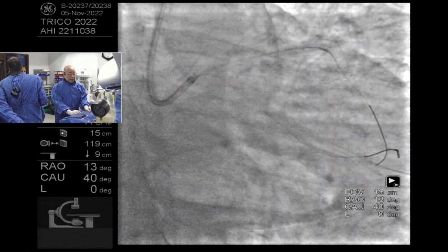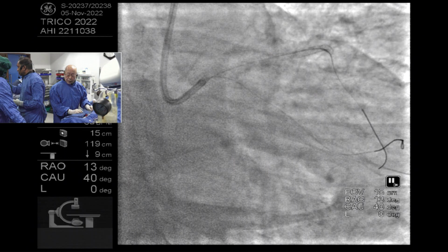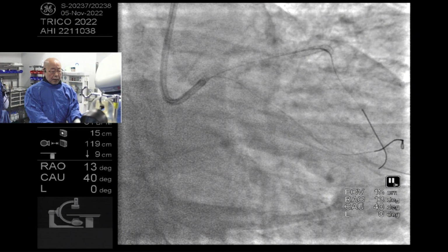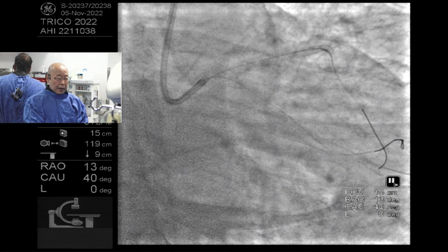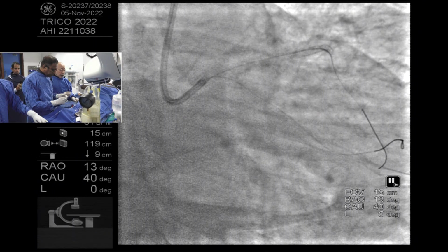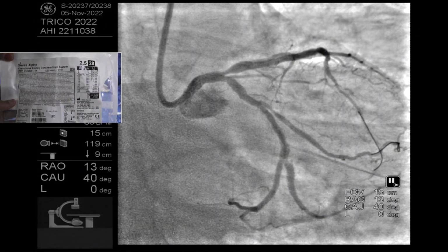Dr. Saito, any opinion about drug-eluting balloon over here? Do you have a drug-coating balloon? We only have it for peripheral. Sometimes we use it in the coronary for in-stent restenosis as off-label use. In Japan, it's very popular to use a drug-coating balloon for small vessels like 2.5, 2 millimeter, and also bifurcation, and of course in-stent restenosis.